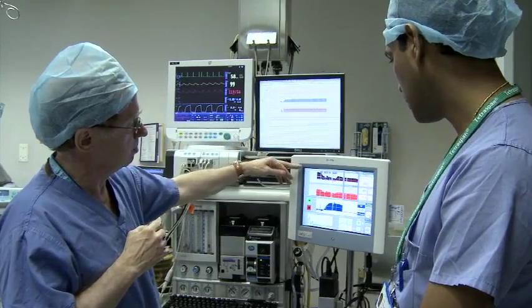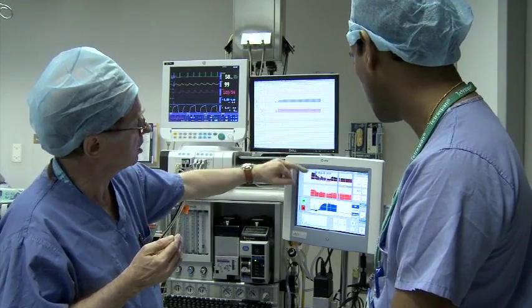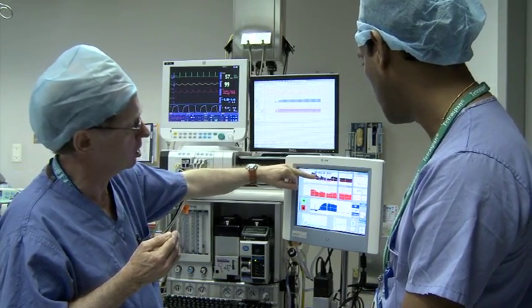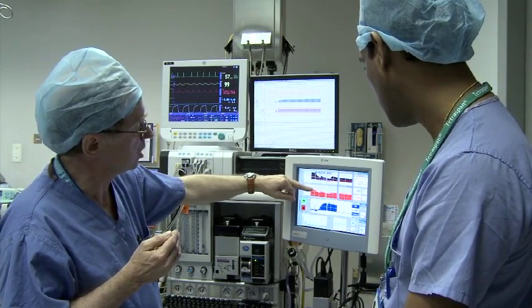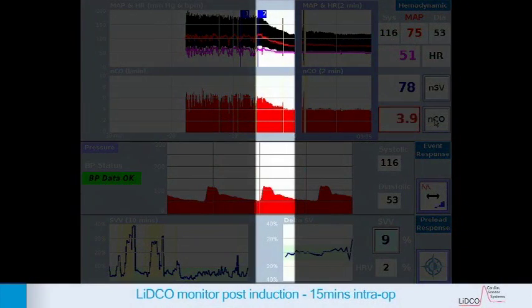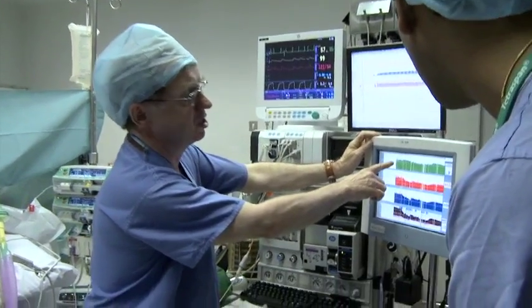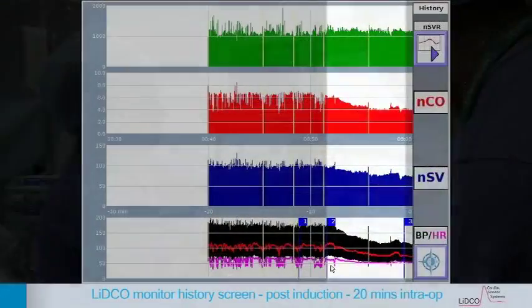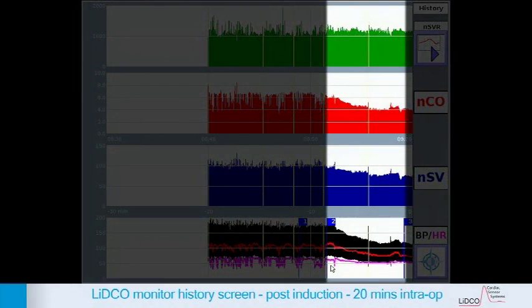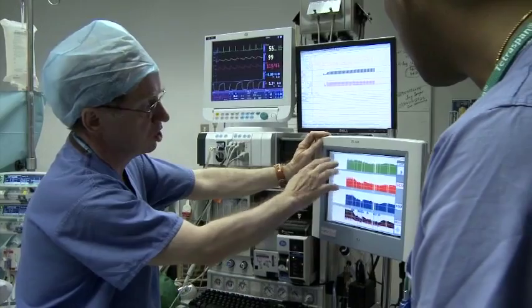As every anaesthetist knows, the blood pressure falls at induction. You can see here, when we start the propofol — not when we start the remifentanil — there is a decline in blood pressure. We also see that this is due primarily to a decline in cardiac output. If we switch to the screen which demonstrates the overall trends, we can see systemic vascular resistance at the top and our blood pressure trace. The fall in blood pressure was not due to a change in systemic vascular resistance; it was due to a change in cardiac output.